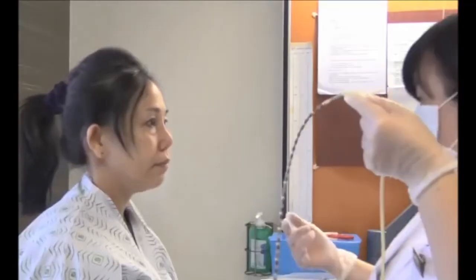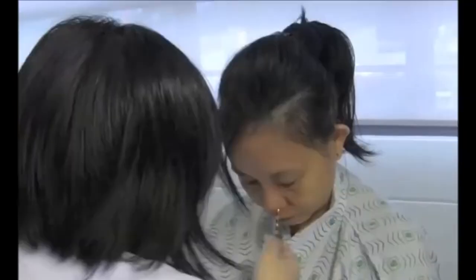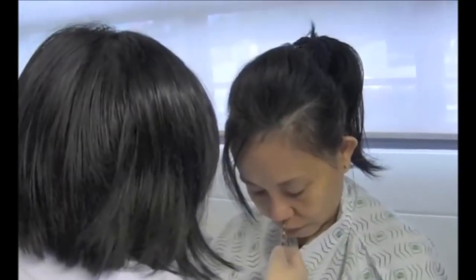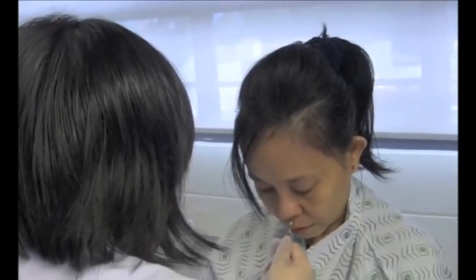The catheter will be inserted slowly into your nose. You will be asked to swallow continuously and this will guide the catheter down.